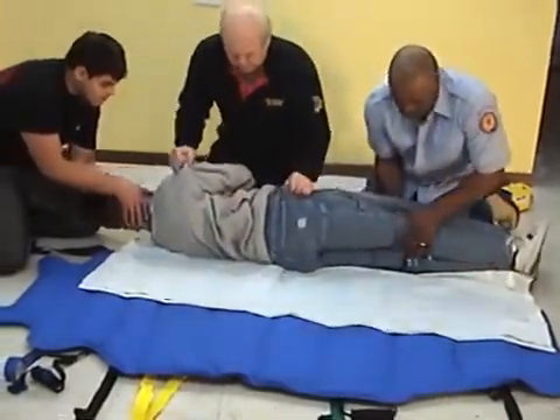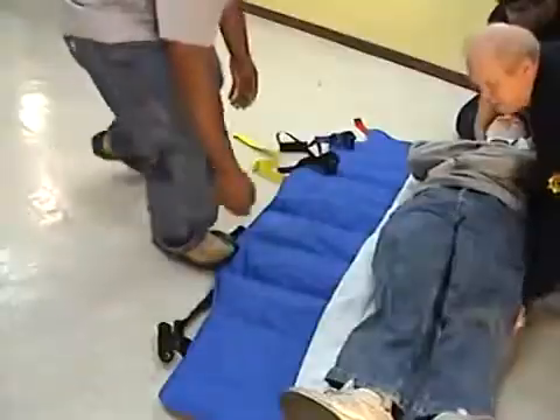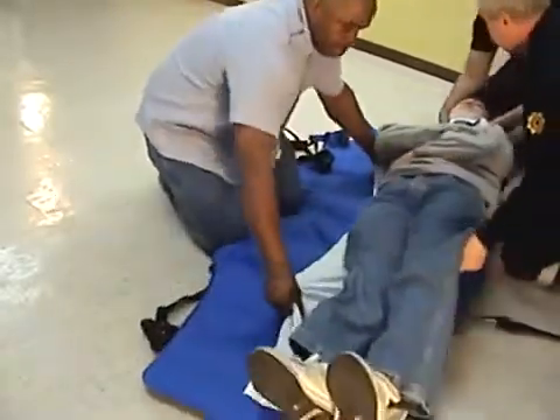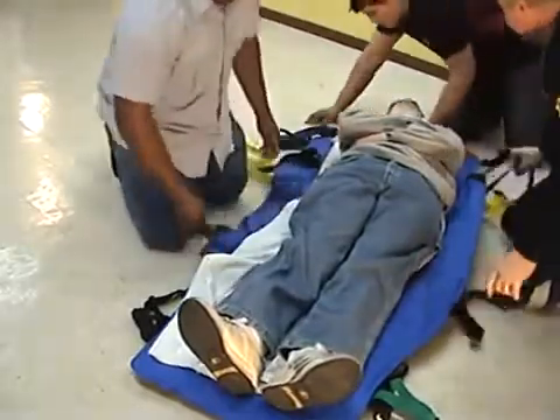Log roll, scoop, or lift the patient onto the unfolded VSB. Using a blanket or bed sheet will make the sliding of the patient easier. Place the patient so that the top line of the shoulders is in line with the top handles.